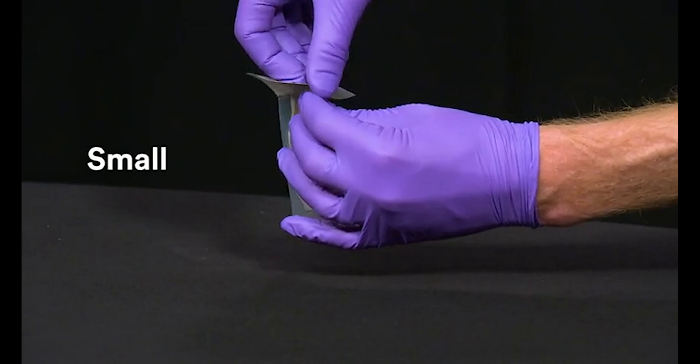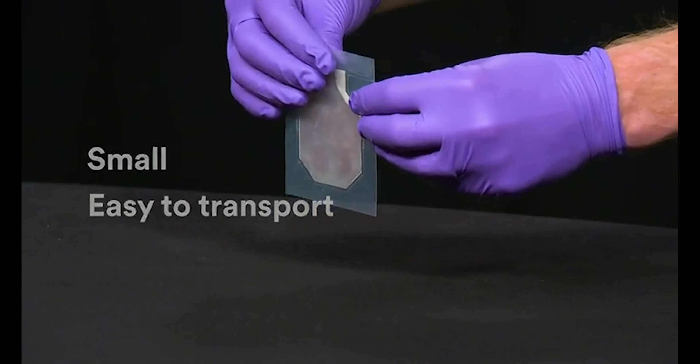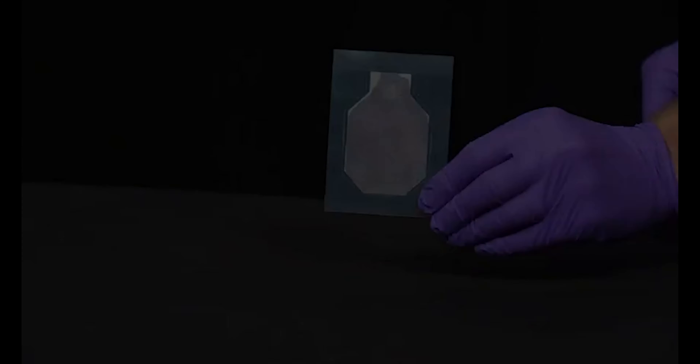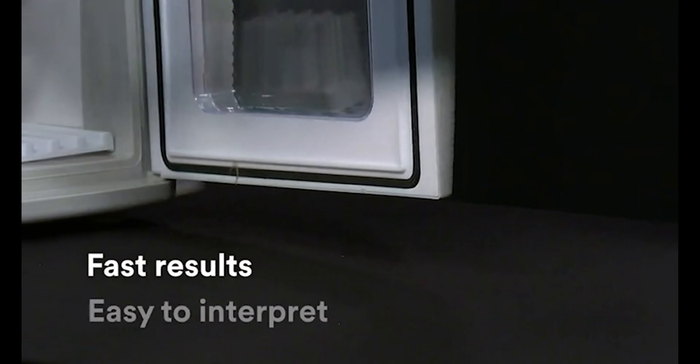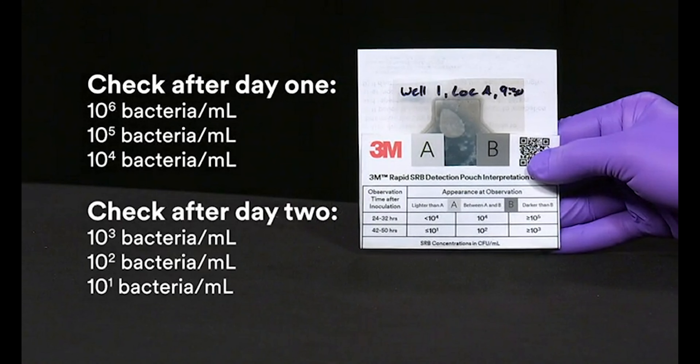The pouch is small and easy to transport. Results are fast and easy to interpret. Positive results turn black, providing quantitative test results in 2 days or less.